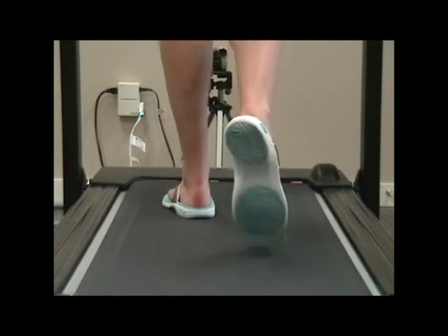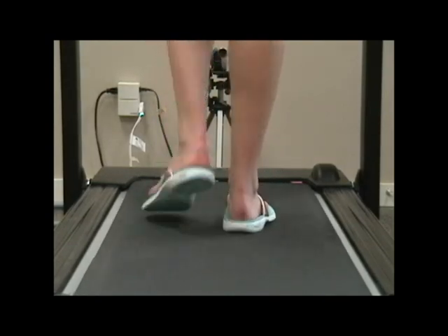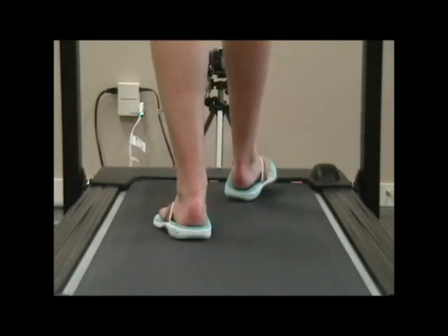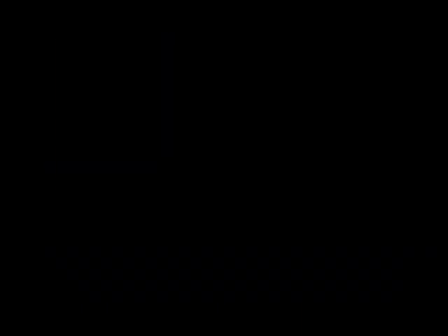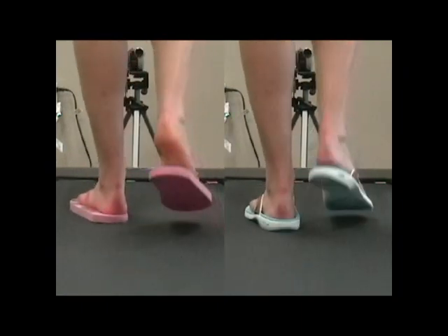Compare her now in the supportive flip-flop. Notice this significant improvement — her ankle does not roll in, preventing over-pronation. Due to the deep heel cup and an engineered strap, the flip-flop no longer looks like it's going to leave her foot when she takes a step.